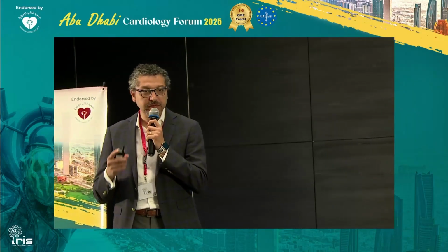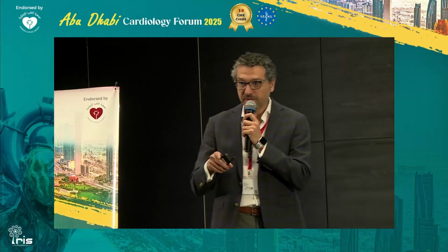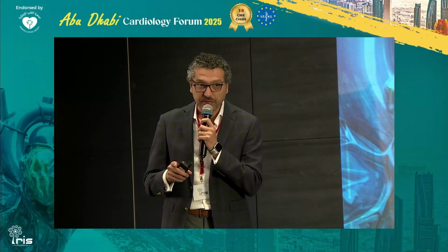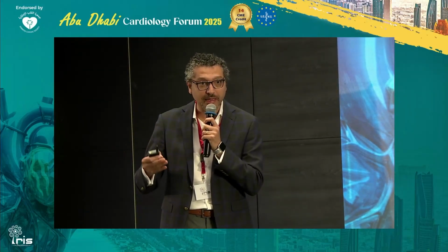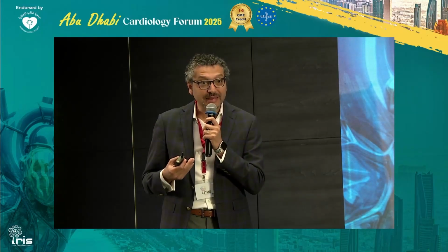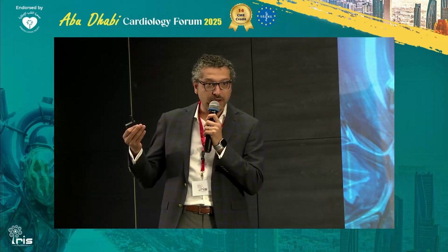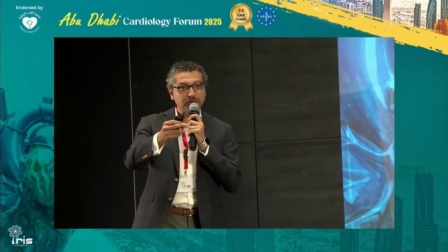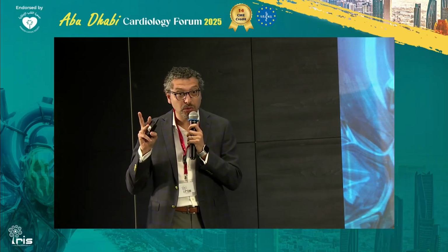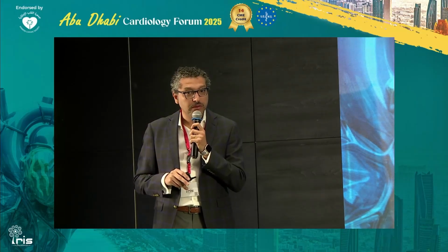Okay, but this is a low-risk patient. He's a 47-year-old. He had mitral valve replacement in 2014. He has HFpEF, not HFrEF, so ejection fraction is maintained. And we know why he had HFpEF, because of the severe mitral regurgitation, right? The patient came to the clinic. He's completely stable, but he had these symptoms. Sure, the cardiac biomarkers are very high. So just put yourself in your shoes. Would you like to have three occluders in this low-risk patient, or would another redo surgery be more prudent?